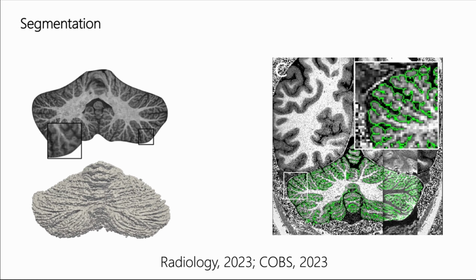And it takes some doing, I have to say. It's not easy to do the segmentations, but we have managed by now to almost fully automate this. And we can make cerebellar cortical surfaces that capture a lot of this fine anatomical detail. And I invite you to compare this to a standard analysis. You'll see that we have a lot more detail that's just missing, typically.